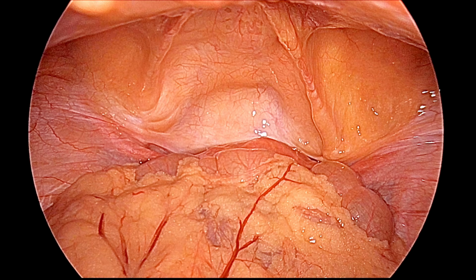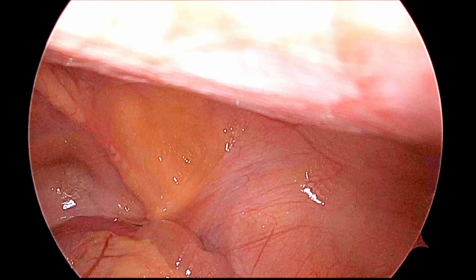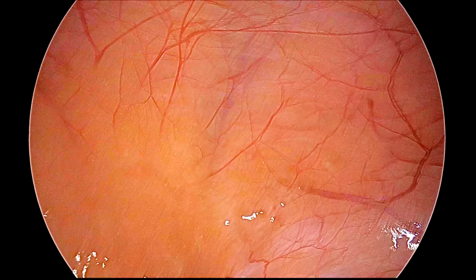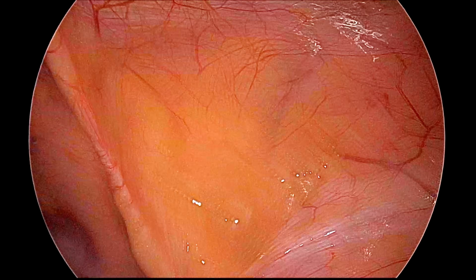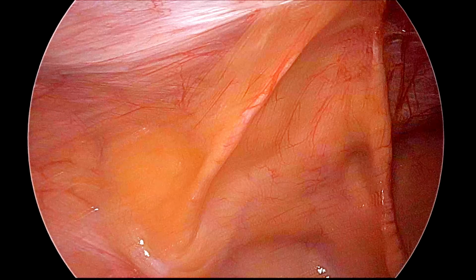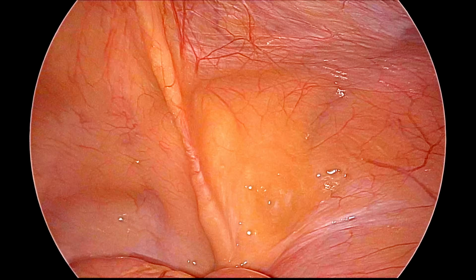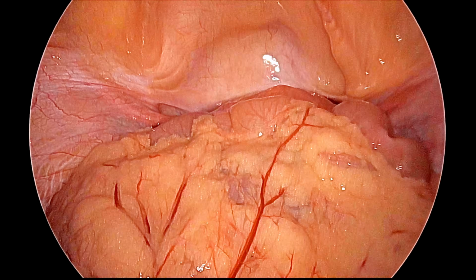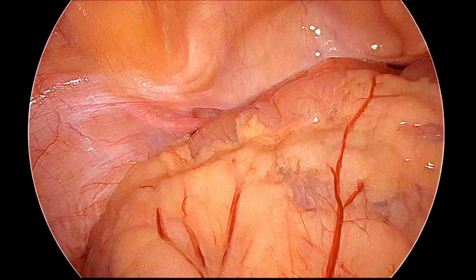So now the patient's head is 30 degrees down, and the first step is that we will sweep all the bowel. Here we can see the medial umbilical ligament, and the inferior epigastric vessel which is visible, this is the deep ring, this is the median umbilical ligament in the midline, and this is another medial umbilical ligament and another inferior epigastric vessel. So the entire anterior abdominal wall is fine. This is the omentum and small bowel, and in front is the bladder.